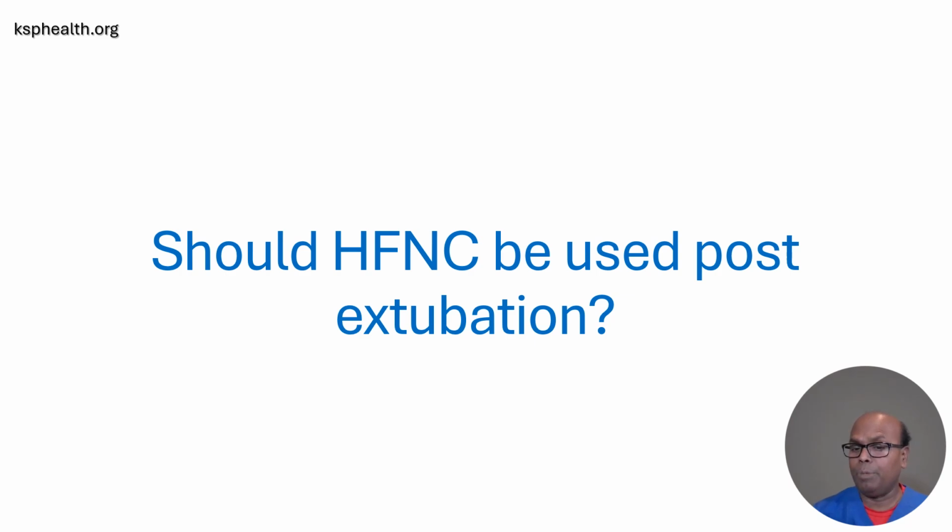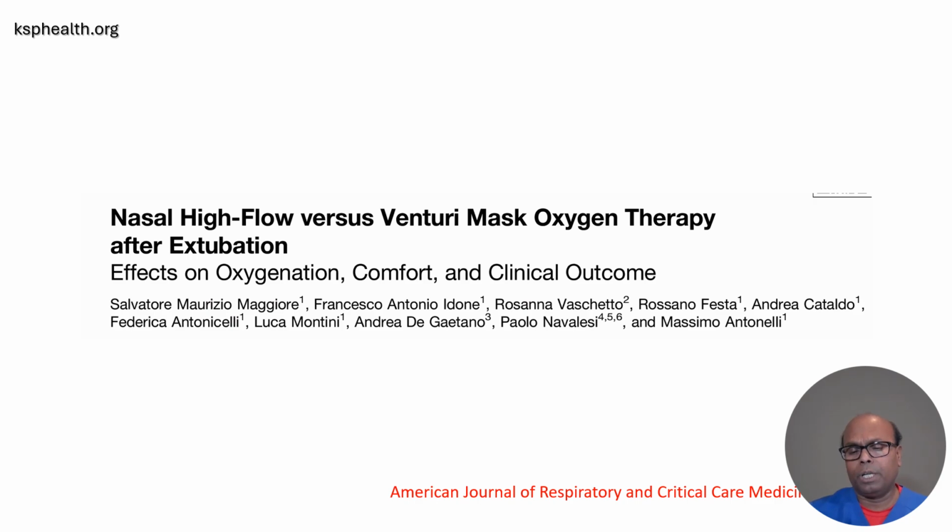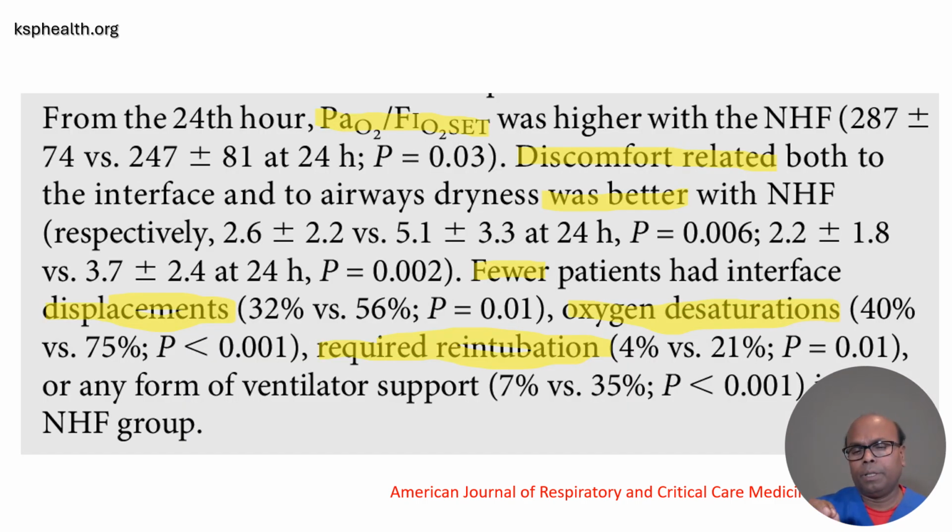Should high flow nasal cannula be used post-extubation? Let's look at the study published in 2014. In this study, nasal high flow versus Venturi mask oxygen therapy after extubation was examined. The data shows those patients who received high flow nasal cannula had higher PF ratio, and discomfort related to airway dryness was better with high flow nasal cannula than the face mask oxygen.